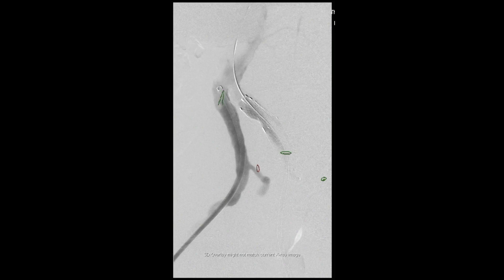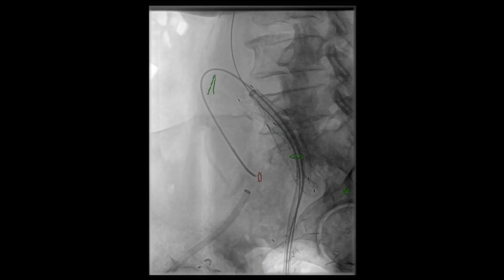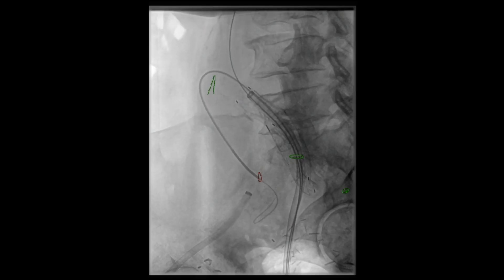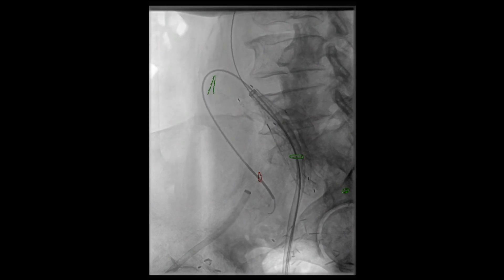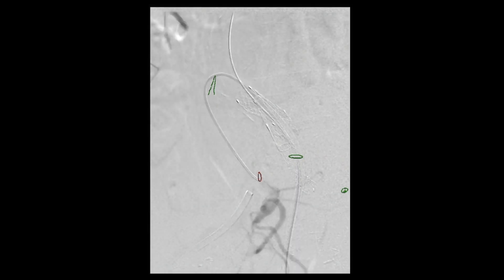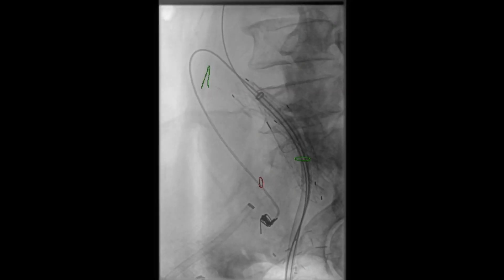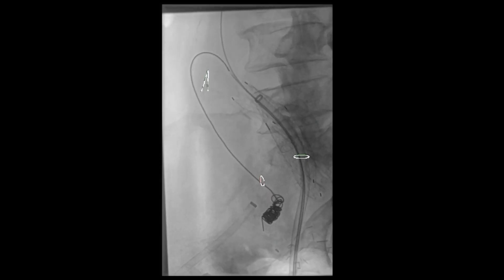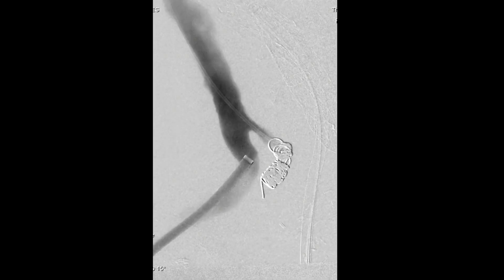This angiogram was done to provide adequate landmarks for our coil embolization of the right internal iliac artery. Using a combination of a curved catheter and wire, we were successfully able to cannulate the right internal iliac artery. Once cannulated, an angiogram was performed to better delineate the anatomy of the right internal iliac artery system. We then proceeded with coil embolization of the right internal iliac artery using multiple push coils, with a subsequent angiogram demonstrating successful coil embolization.